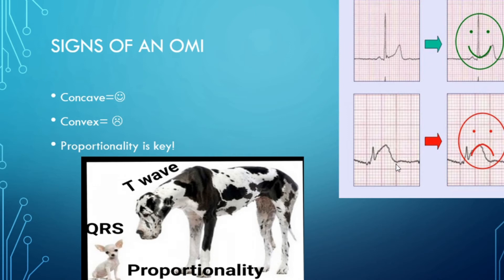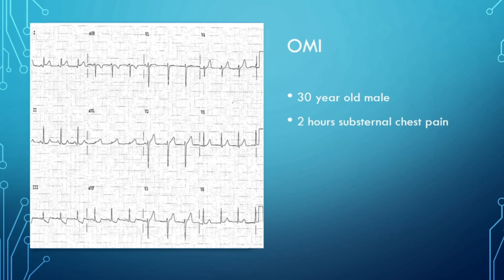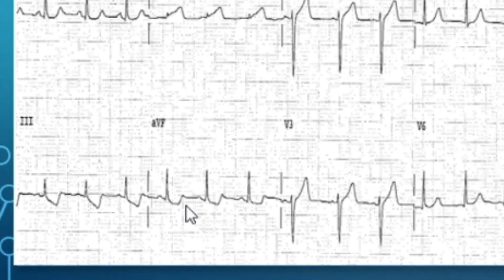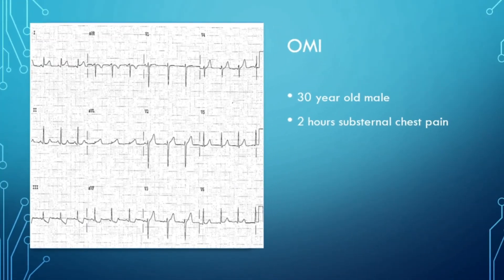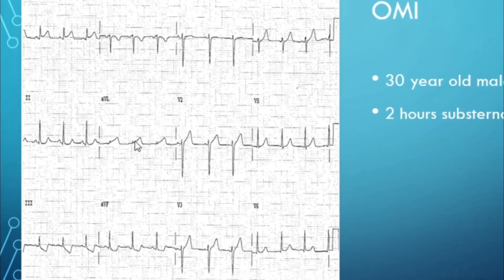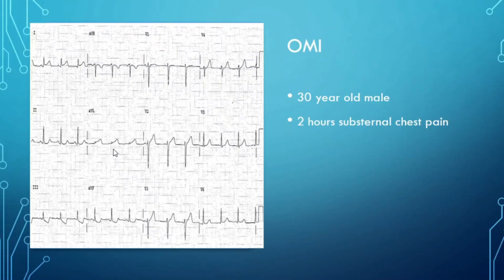Now let's get into occlusion MI identification with some cases. This is a 30-year-old male complaining of substernal chest pain. Direct your eyes to the inferior leads — 2, 3, and AVF. See that T wave inversion and depression? Lead 3's best friend and most reciprocal lead is AVL. Look at AVL — see that small QRS and that massive T wave? That is disproportionate: very small QRS, massive T wave. That is a hyper-acute T wave.